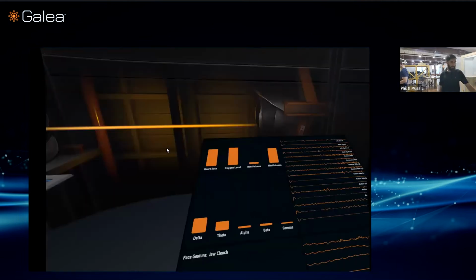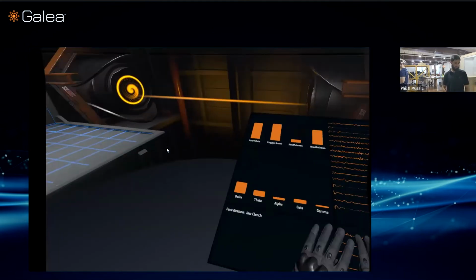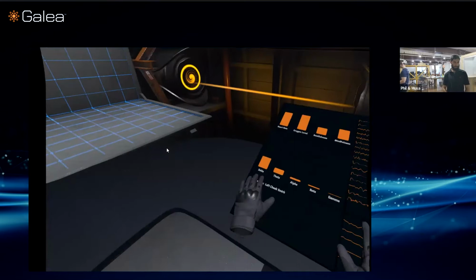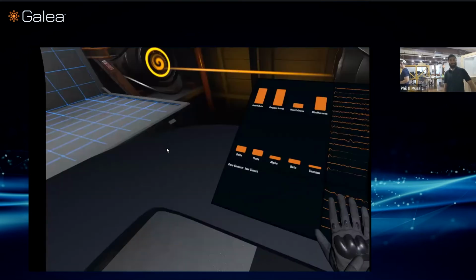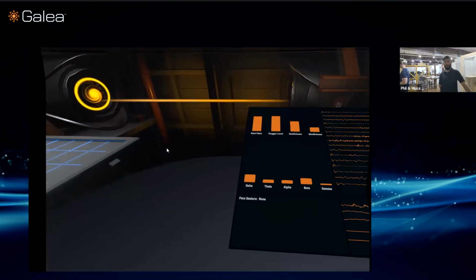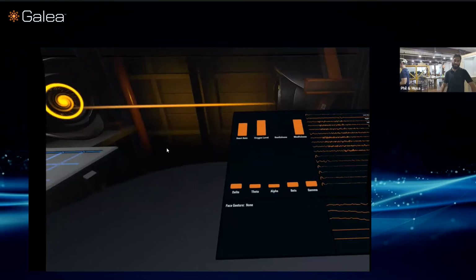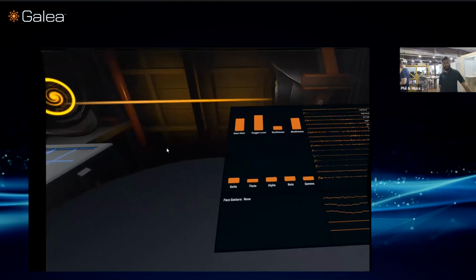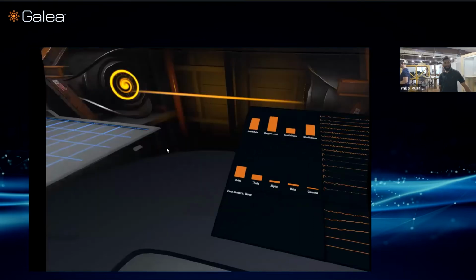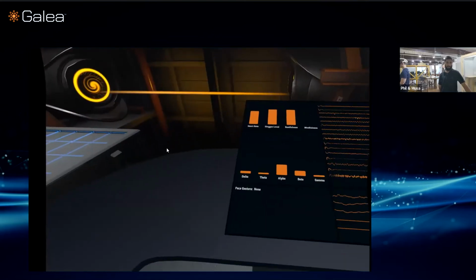Cool. So we've talked a little bit about these derivative metrics up here. Should we talk a little bit about average band powers now, Musa? Yeah, sure. As we mentioned before, all the graphs on the right will provide you with raw biometric information, but parsing useful data out of these raw biometrics is quite difficult. On the left, we've shown you how we've started to create these first level derivative metrics. And one of these metrics is your average band power.